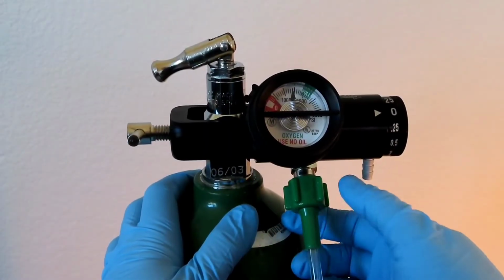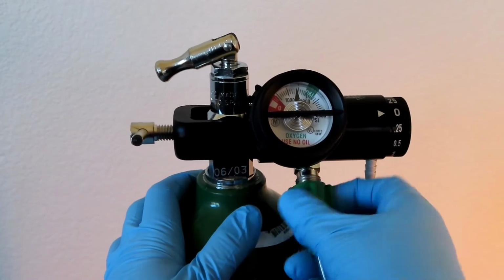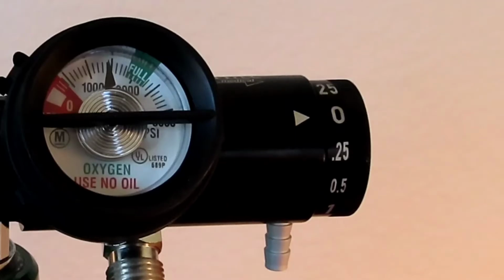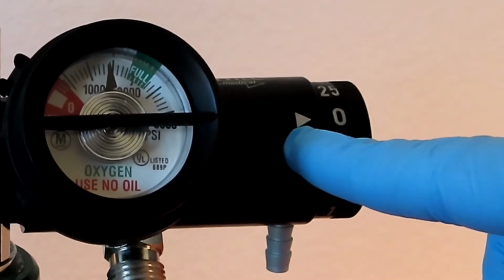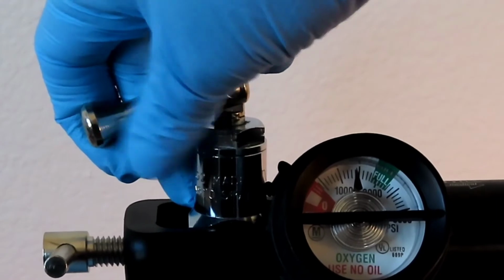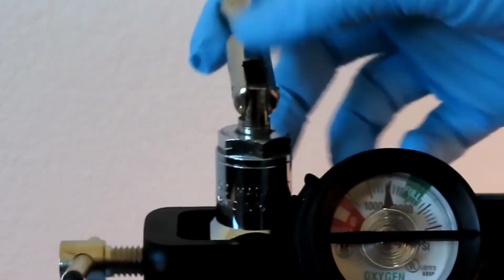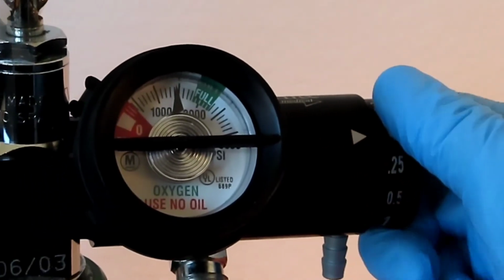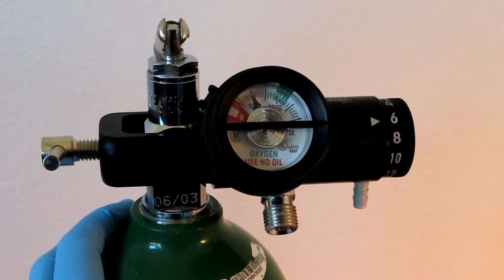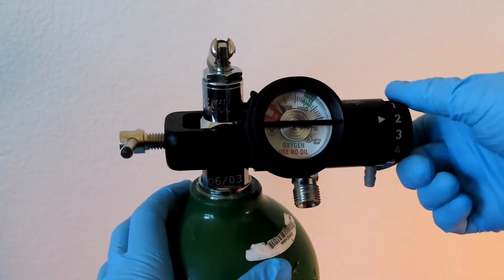When you're done, simply disconnect your CPAP tubing. And to bleed the regulator, you just make sure it's still on zero. And you are going to turn it until it stops, and open up the flow meter to allow the regulator to bleed. Make sure you set it back at zero.